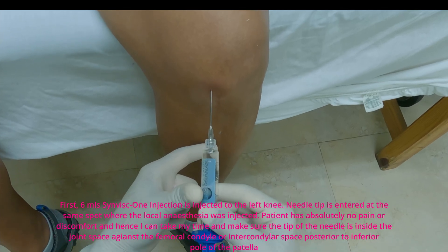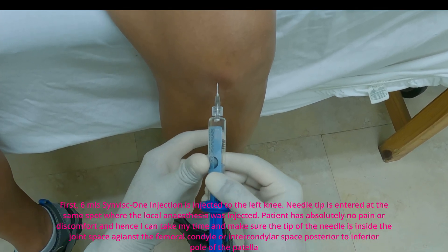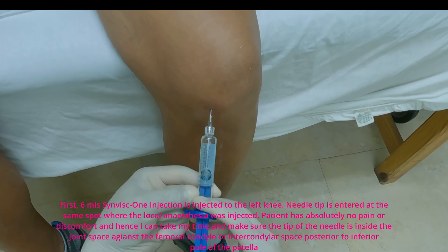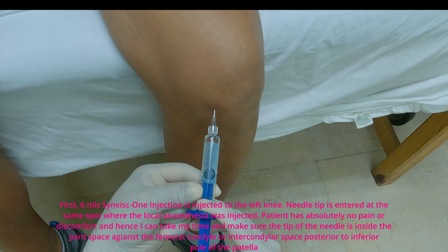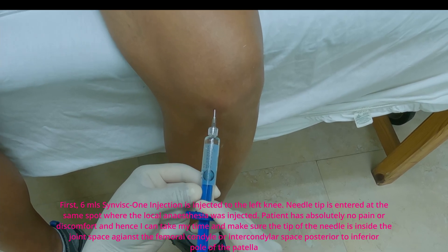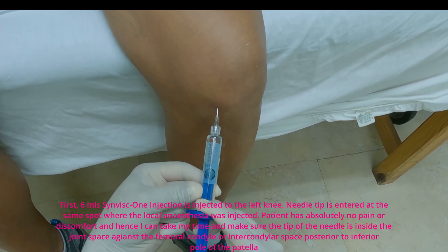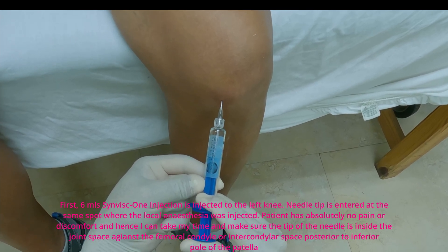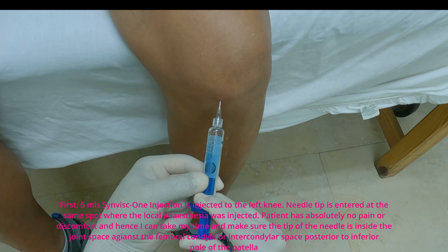The needle tip is entered at the same spot where the local anesthesia was injected. The patient has absolutely no pain or discomfort, so I can take my time and make sure the tip of the needle is inside the joint space against the femoral condyle or intercondylar space, posterior to the inferior pole of the patella.